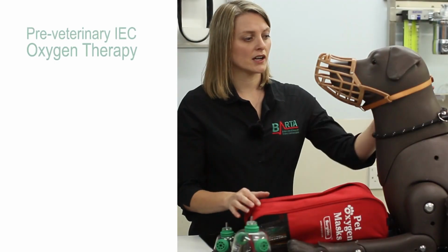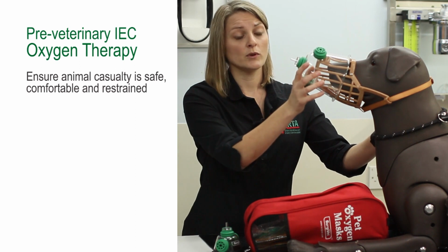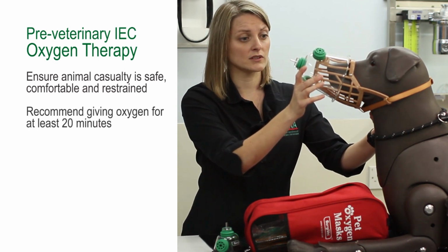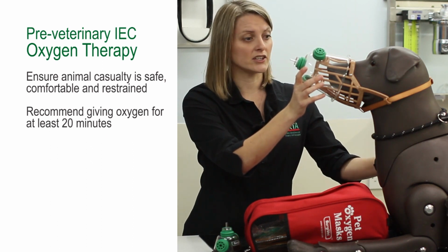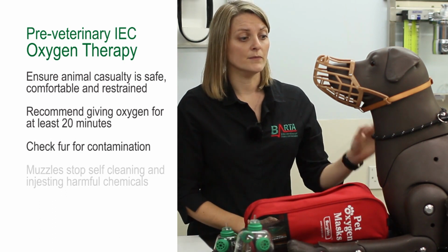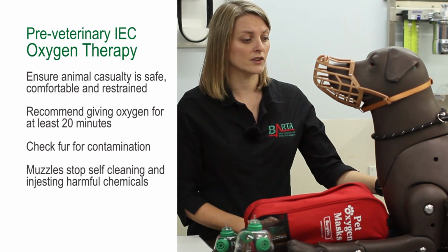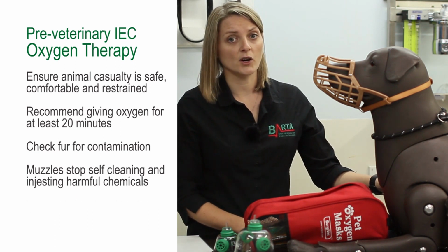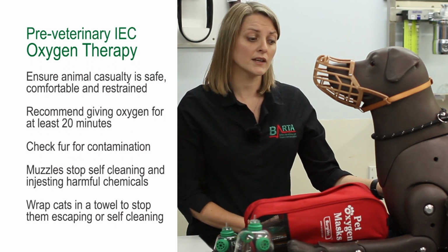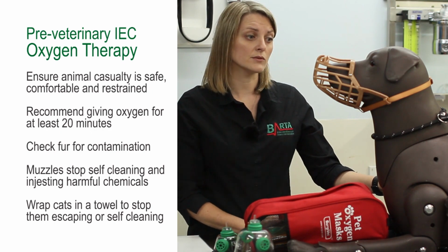Once we've got the animal comfortable and restrained, and we might have it now on our oxygen therapy, we recommend at least 20 minutes as an initial oxygen dose for these animals. We might start thinking about other considerations. So is the animal's fur and coat heavily contaminated? The muzzles are very handy for this to stop them self-cleaning and ingesting any further chemicals. Equally, cats might be handily wrapped in a towel to stop them either escaping or, on regaining consciousness, also to stop self-cleaning afterwards.